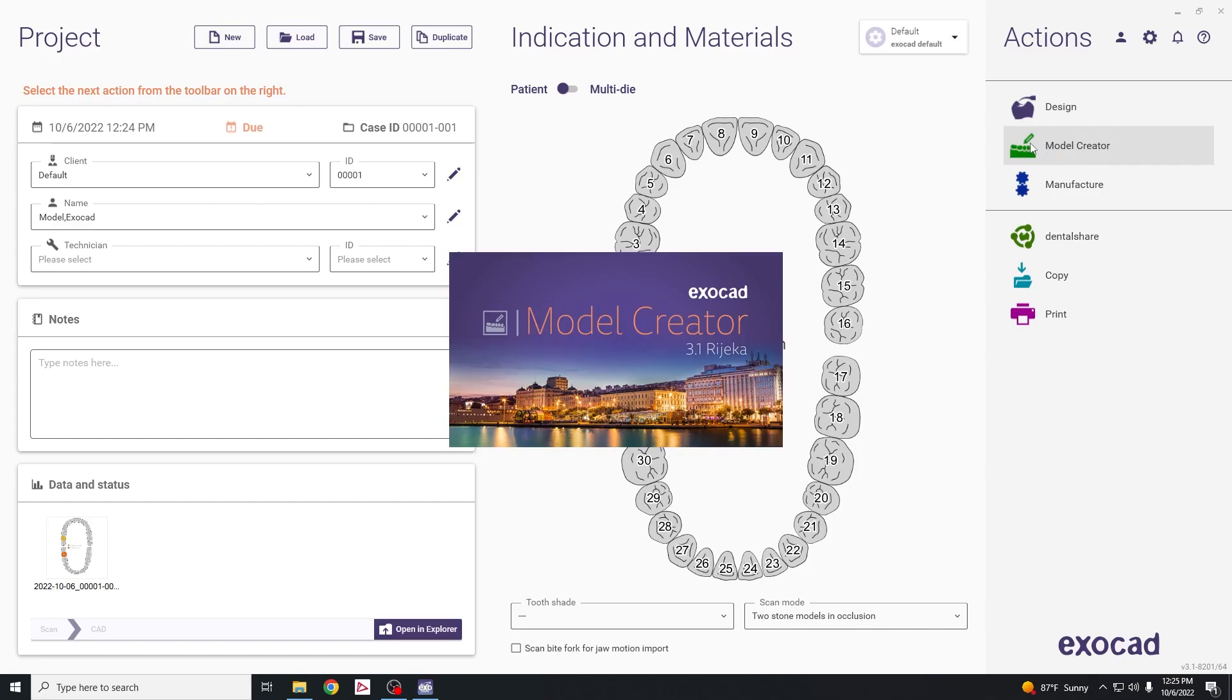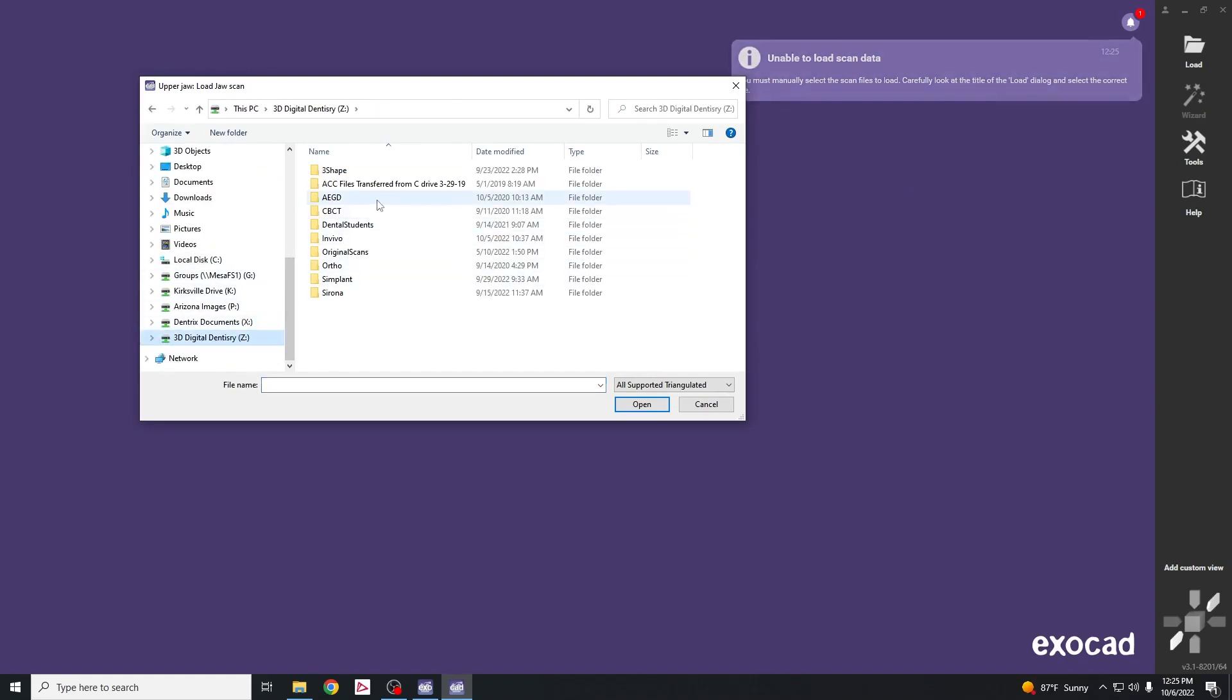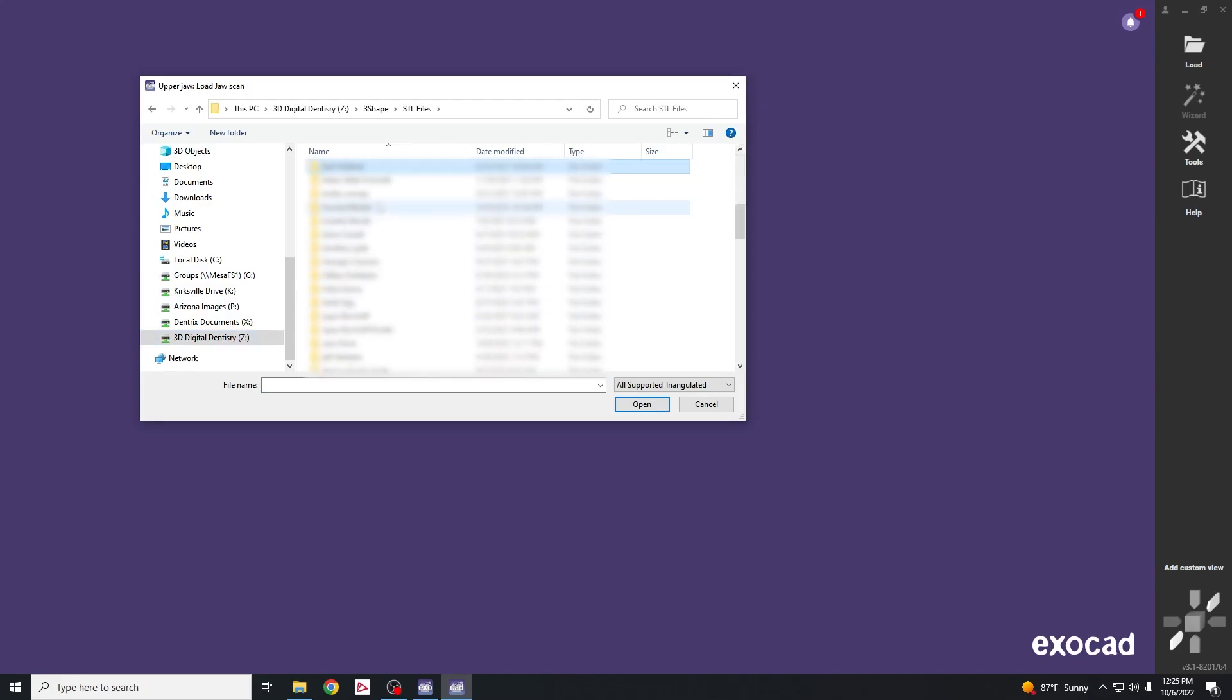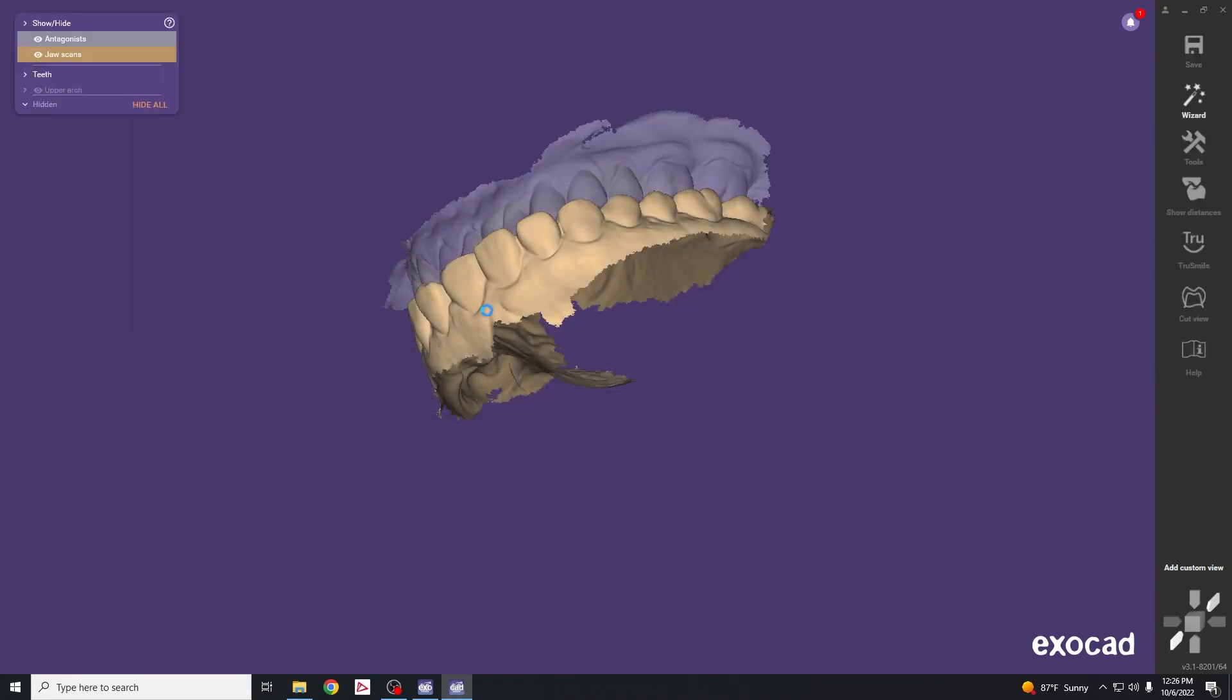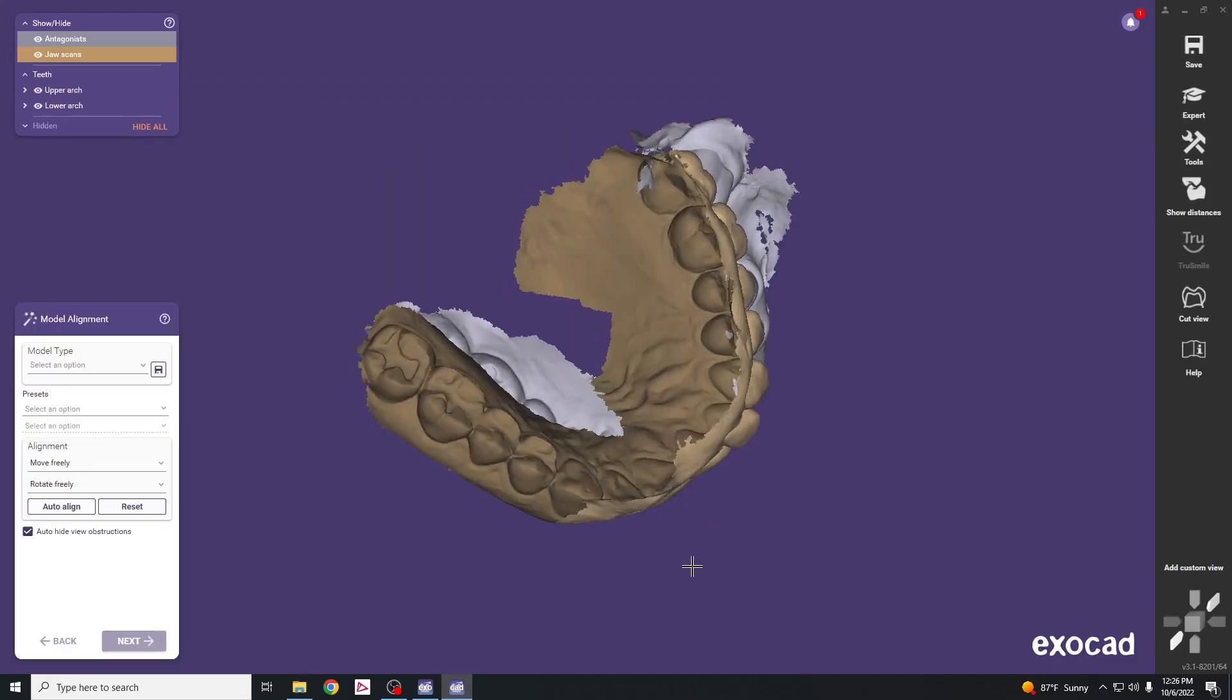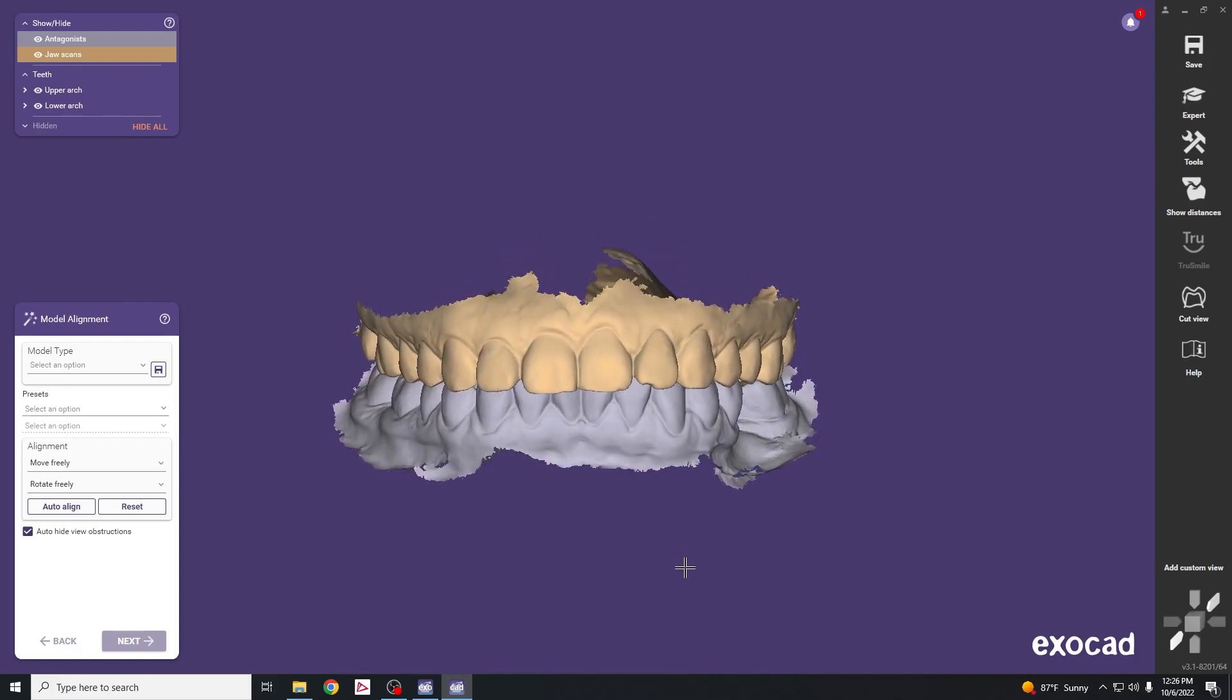This will launch the model creator module which will ask us to load the files we just created through the Trios software. Click on Z drive, 3 shape, STL files, and find the patient folder. Load the upper jaw scan, then the lower jaw scan. This allows us to see both scans in the software.